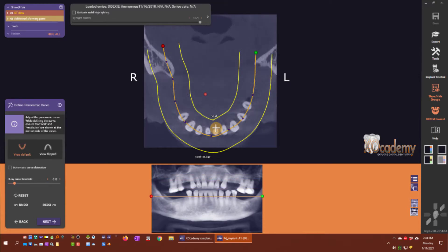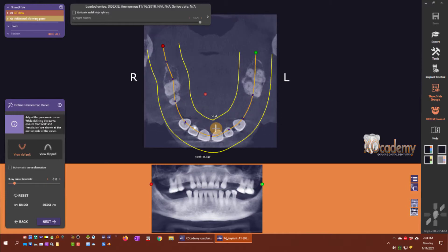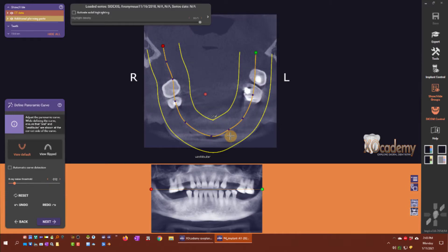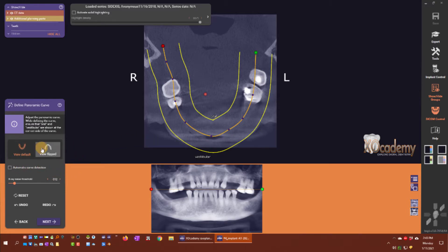That's how we define the panoramic curve. If you would like to view it flipped where the anterior of the arch is toward the top of your screen, just click view flipped.